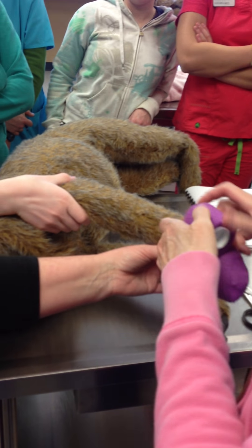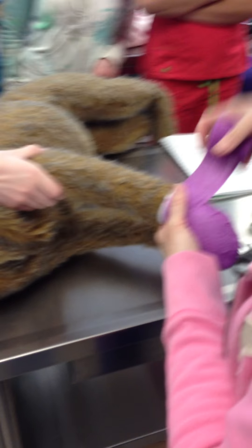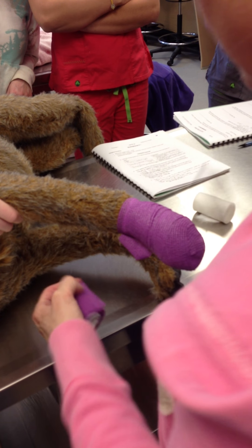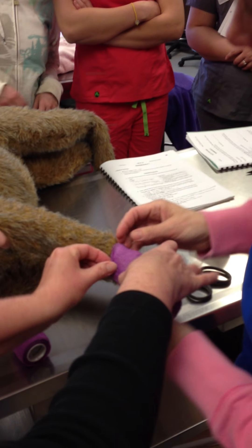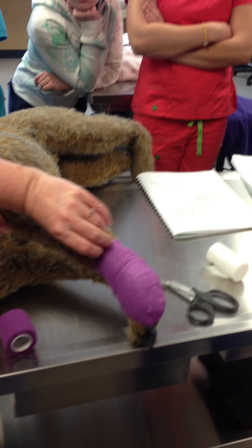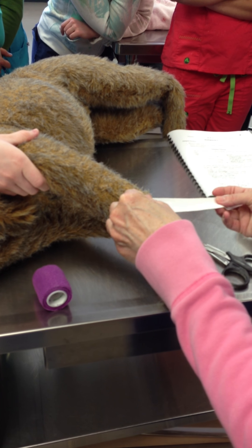And then over that 50% as we go up. Does that wrap stick to fur? No. Make sure that it's not too tight — you should be able to get two fingers in there. If we don't do this next step, this patient will have this off in a millisecond, so this is very important.